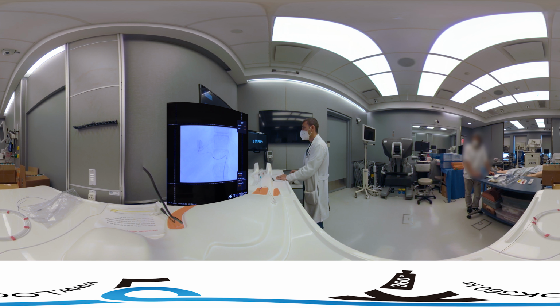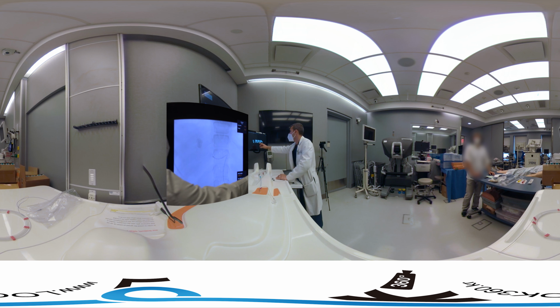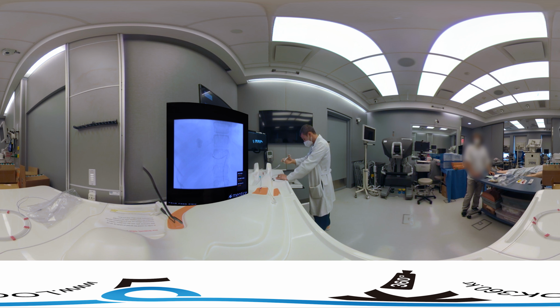So we're going to open up our collimation, and then for this we're going to do a DSA. So again, I'm going to hold down on the pedal for the DSA. It's going to gray out, and then we're going to deliver our contrast. And now you can see that that branch vessel supplying the tumor is completely static, and that we don't see any more filling of the tumor. And that the rest of the hepatic branches are all patent. So that's the end of our procedure.